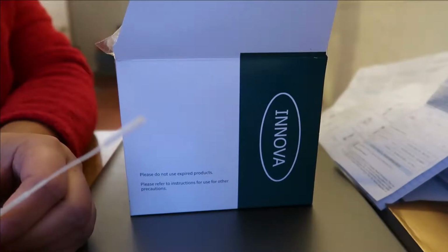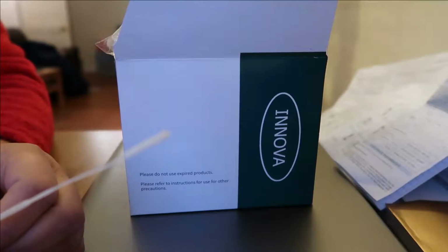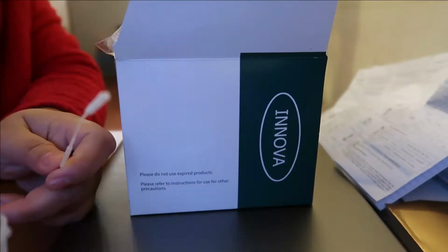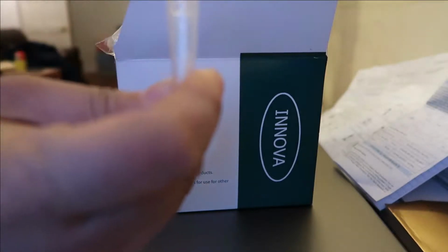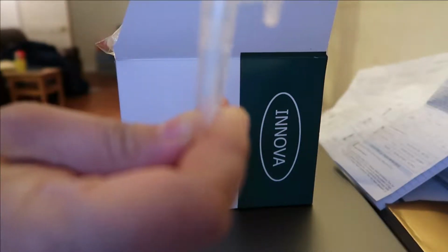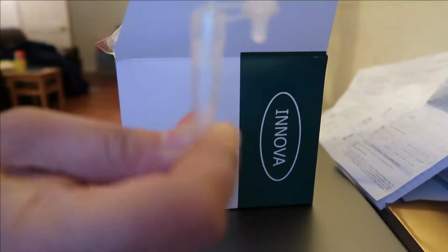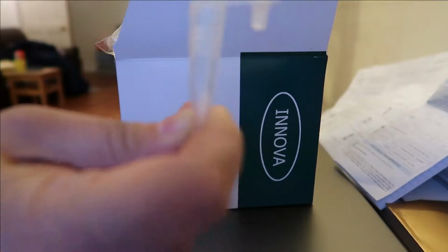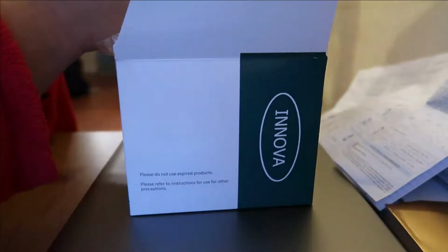Put the swab that has collected the specimen into the extraction tube. Hold and press the swab head against the wall of the tube while rotating the swab for about 10 seconds to release the antigen into the extraction tube. So that's why you need to have a timer, because you need 10 seconds to dissolve this here. So you put it here and then you press. Then for 10 seconds, 1, 2, 3, 4, 5, 6, 7, 8, 9, 10.